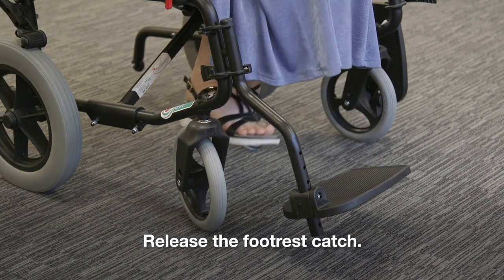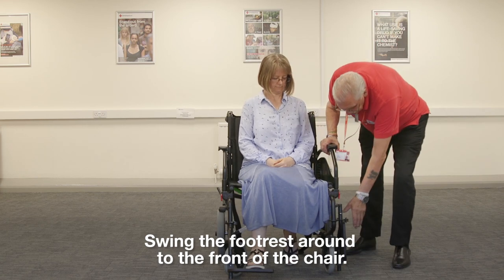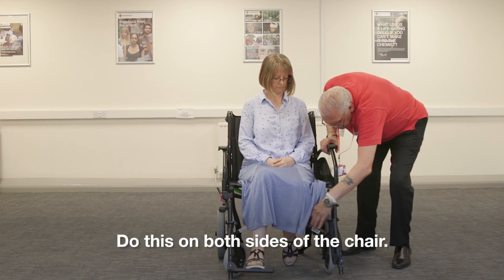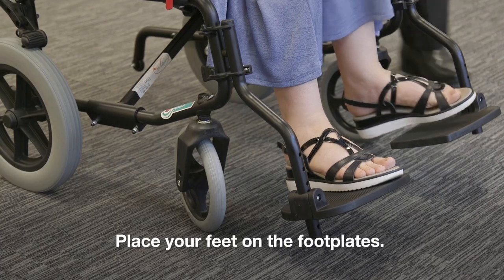Step 3: Release the footrest catch. Swing the footrest around to the front of the chair. Do this on both sides of the chair. Drop the footplates down. Place your feet on the footplates.